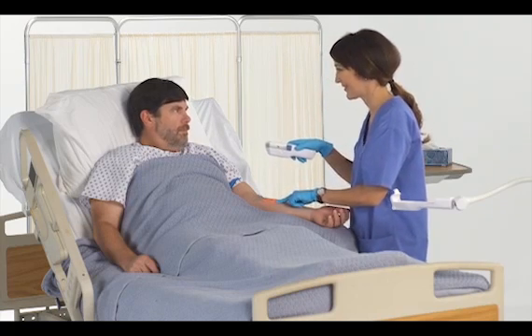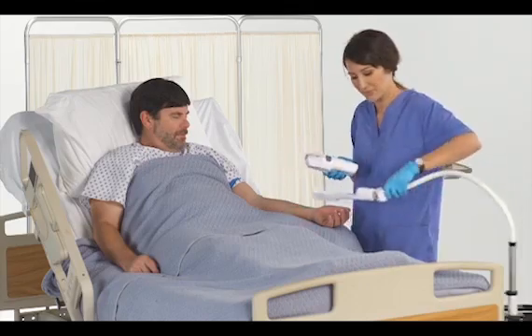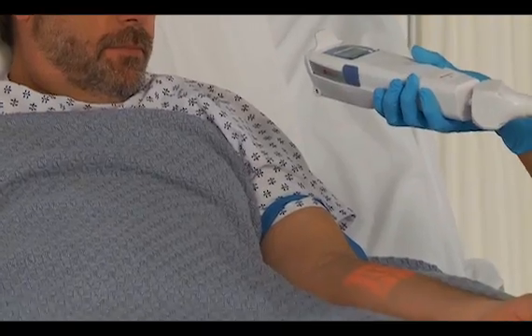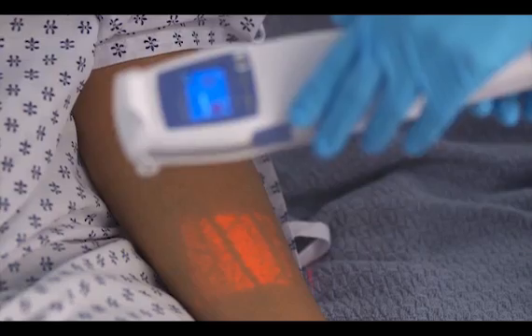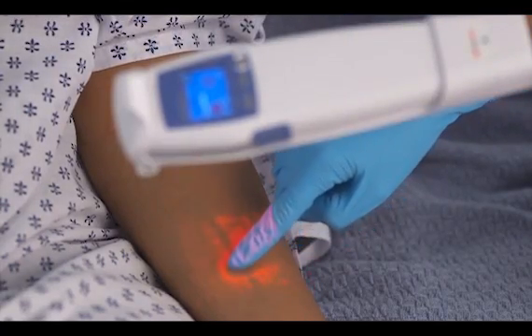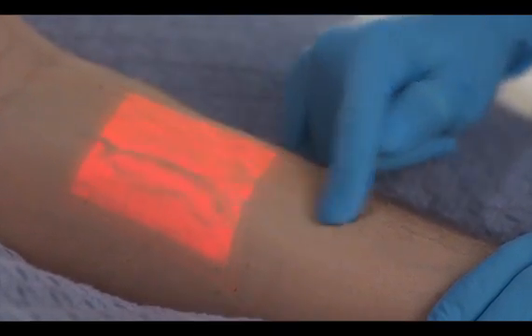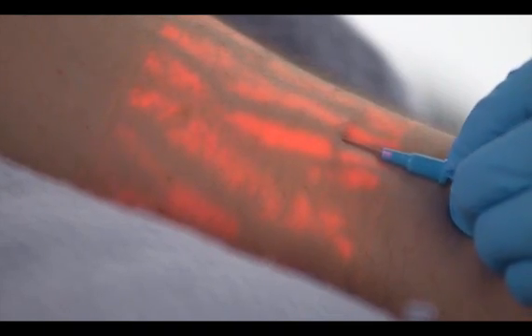Once you locate the vein you want to stick, you can easily place the AccuVein AV400 in the hands-free accessory. This will allow your hands to be free to perform the venipuncture. Always leave the AccuVein AV400 vein display light on when starting the venipuncture. This will allow you to assess the vein as you stick.